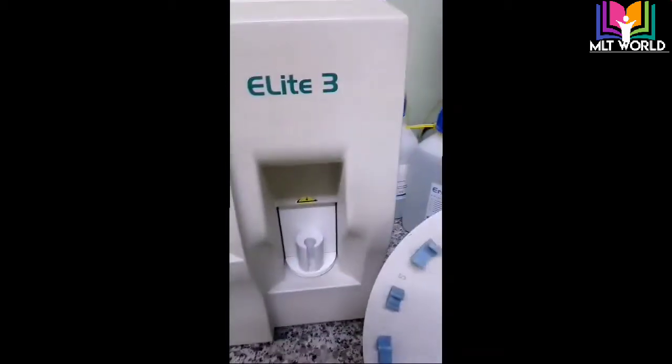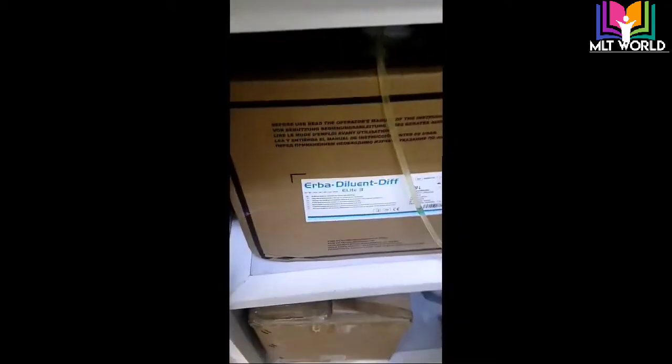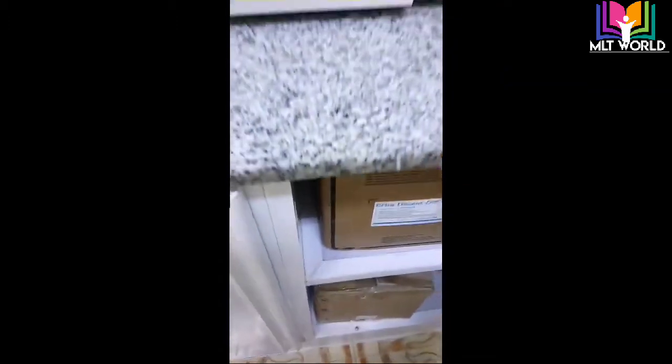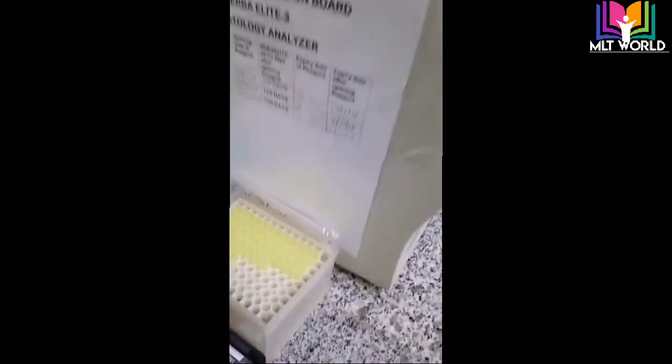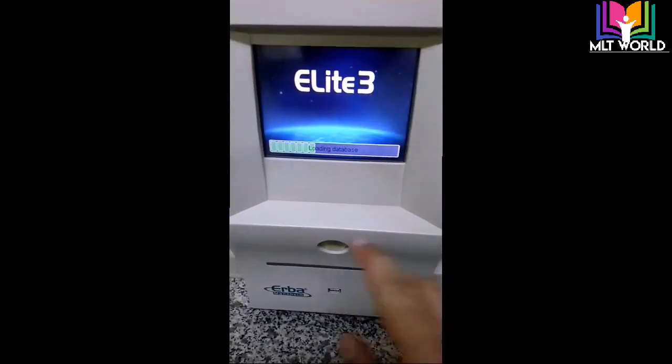A good point of this machine is that there are only three reagents: one is Arba Lyse, one is Arba Cleaner, and one is Arba Diluent, with a separate waste bottle. One important thing to note is the on-board stability of the reagents. You must record how many days the reagent remains stable after opening, because it will affect your results.